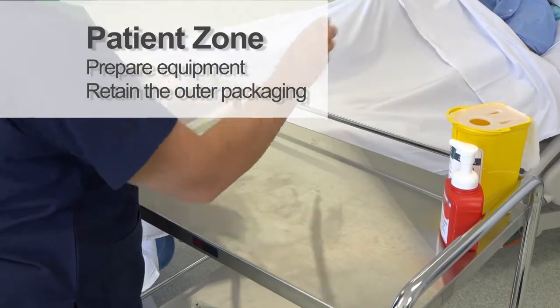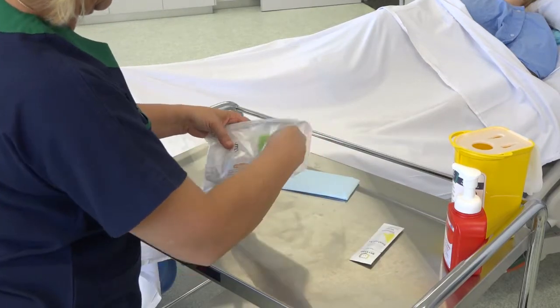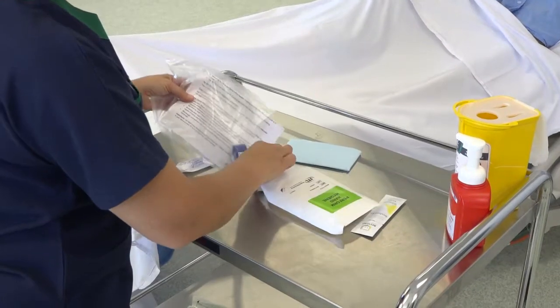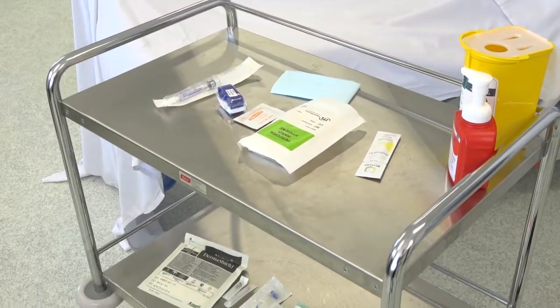Check the packaging for any damage and check the expiry date. Open the outer layer of the IV pack and sort the equipment onto the trolley. Retain the outer packaging with the insertion sticker and the patient information sheet.